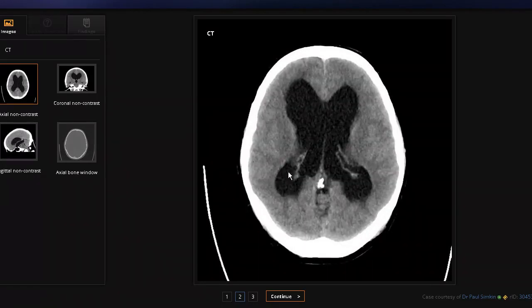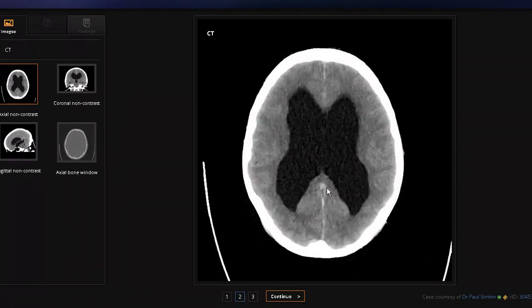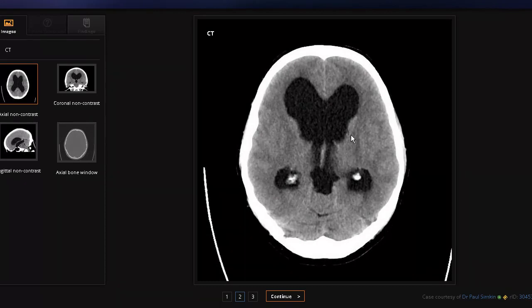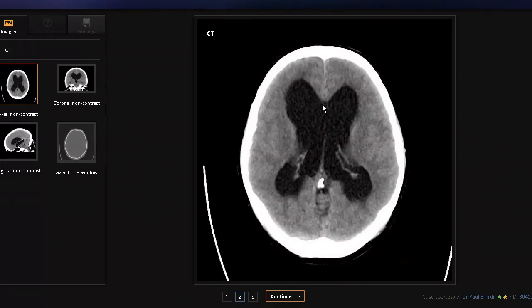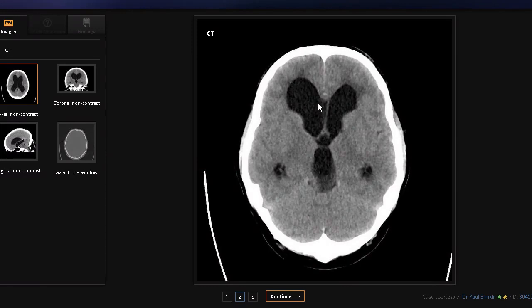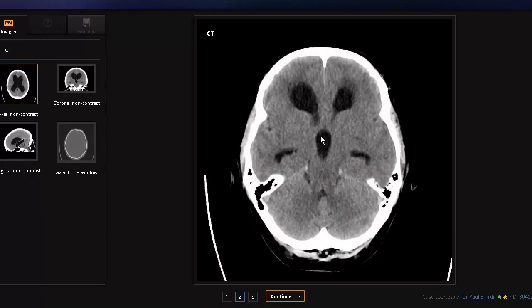Coming further down, because the lateral ventricle is C-shaped, it appears discontinuous. We're looking at the posterior horn at the back, and at this point more probably the inferior horns. Up in front, the lateral ventricles are communicating with the third. Going further down, you can appreciate the septum pellucidum. Here is the third ventricle — isolated in the center with the thalamus on the side — but it's still too large. There is still hydrocephalus here.